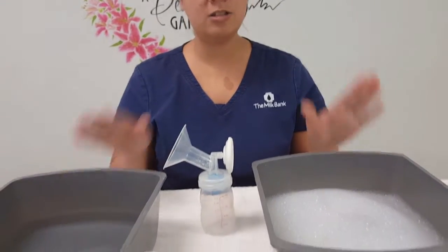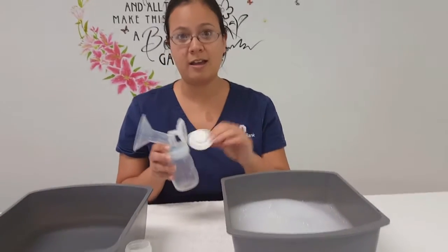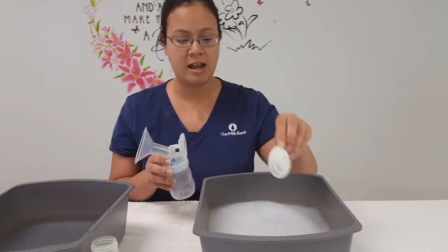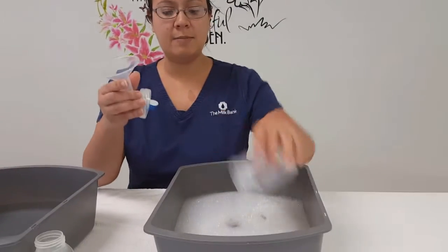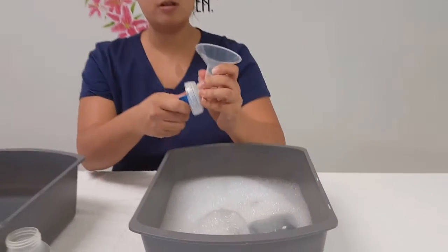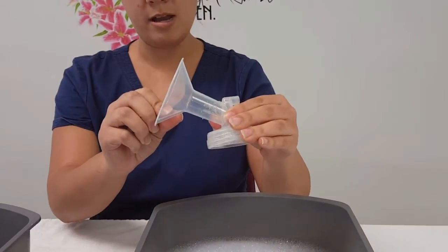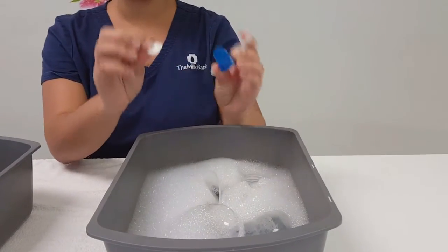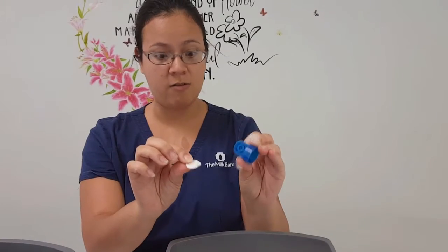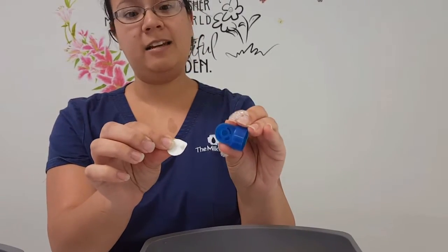The first thing I like to do is wash everything in a bucket because some of the pieces are really small and I don't want to risk them going into the drain. So I have a bucket of hot water here, and I make sure that I take everything apart. My flange doesn't come all the way apart. Mine is one solid piece, but some of them come apart. And then another important thing is to make sure you take the white part, the membrane, out of the valve, because you want to make sure every nook and cranny gets nice and clean.